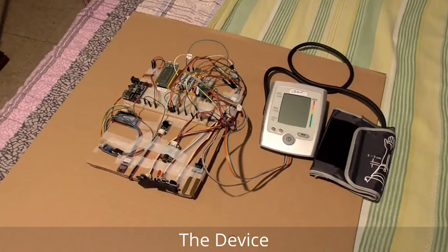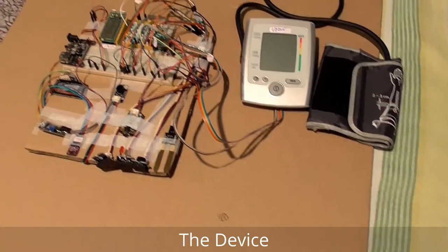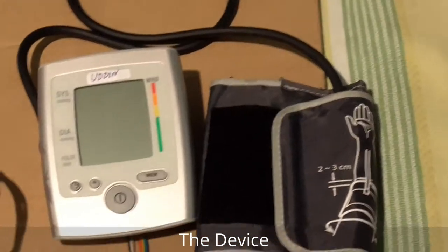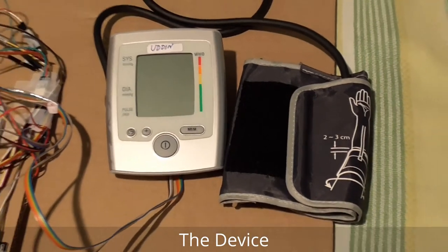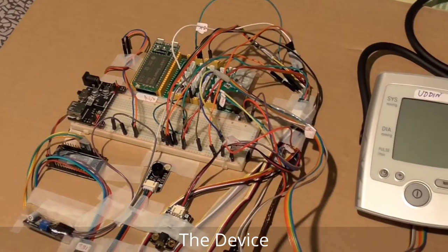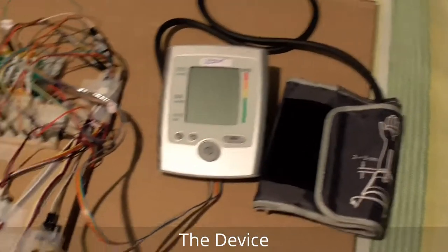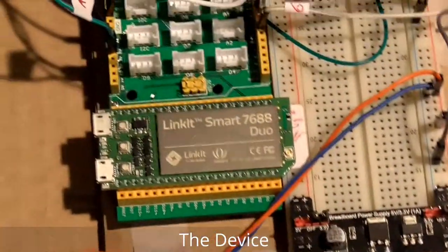This is the device used for monitoring the patient continuously. Here you can see the blood pressure sensor, which can measure the blood pressure of the patient. It is connected with a microcontroller so that we can stream the blood pressure data to the cloud.